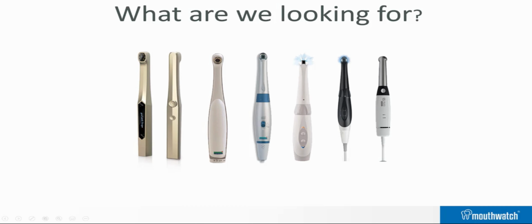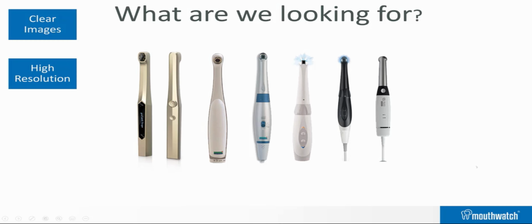So when we're choosing a camera, there are a lot of things that we want to watch out for. There are a lot of options on the market. And so when we are researching cameras and deciding what we want to purchase for our office, we want to make sure that the camera we choose provides clear images, that it has a high resolution, and we'll need to choose between fixed focus or autofocus.